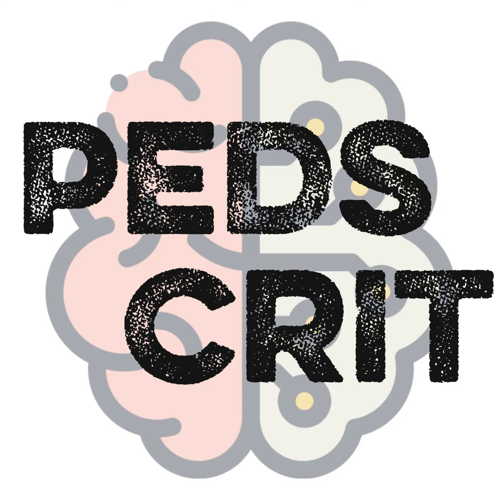If we are at 8 Hertz and the patient is still really hypercapnic, and by hypercapnic I mean the pH is below a certain threshold, because to be quite honest, unless you have a patient with severe traumatic brain injury, I don't really care about CO2, it's about the pH. I think many people will feel comfortable if the pH is as low as 7.20. I would go a little bit lower, but let's say 7.20.